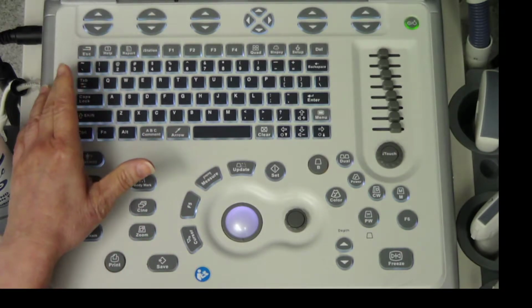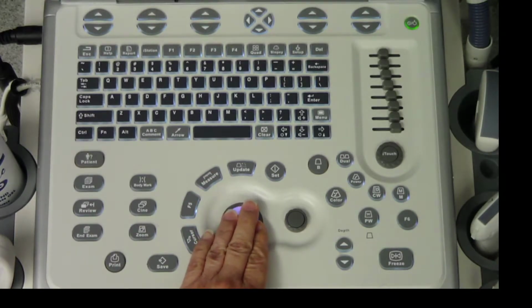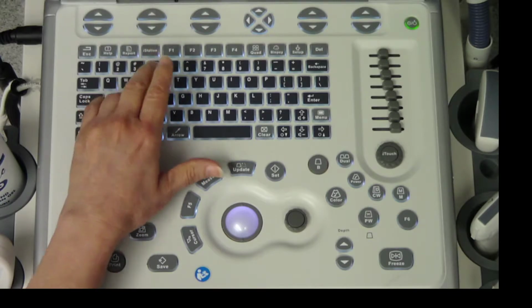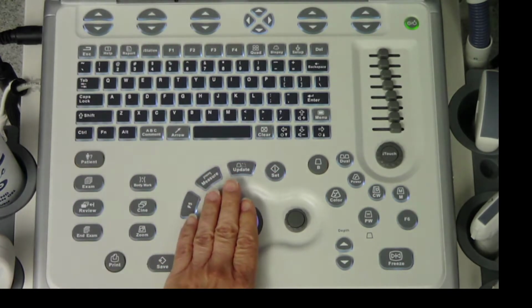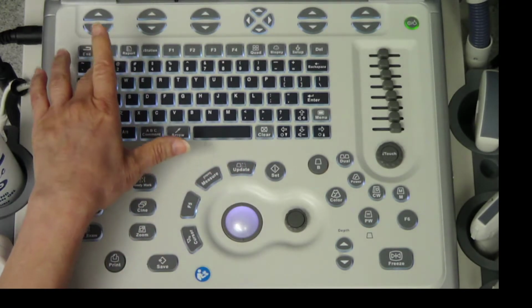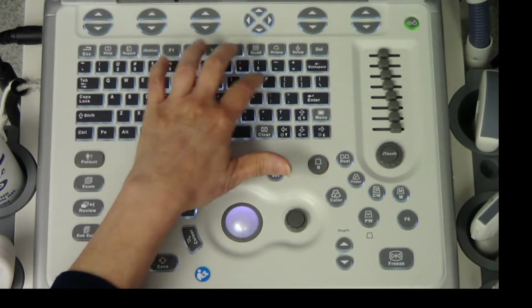So when we were doing patient, in this field you're going to want to put what we are covering. In this case it'll be shoulder. And this will be whatever class that you are in.